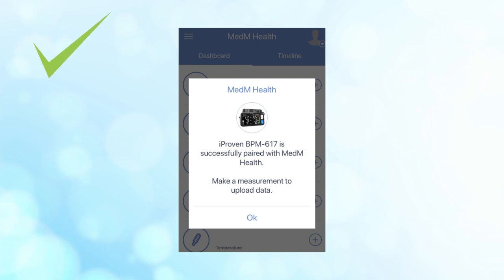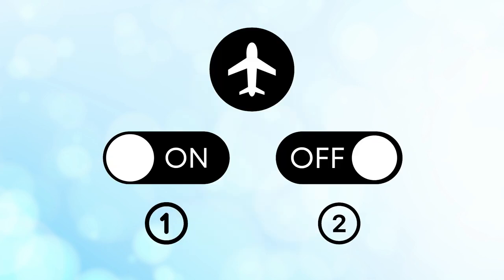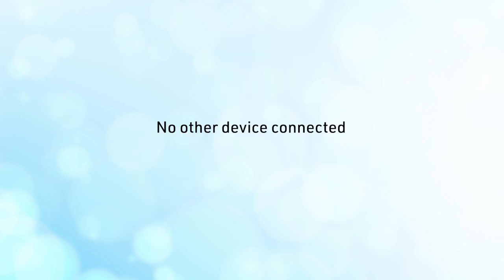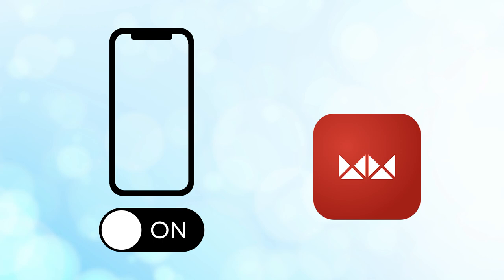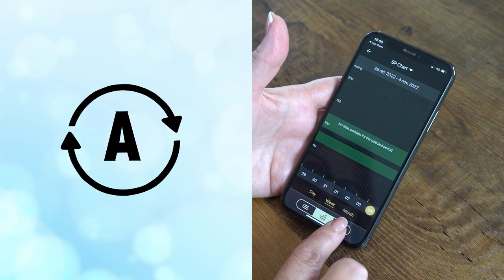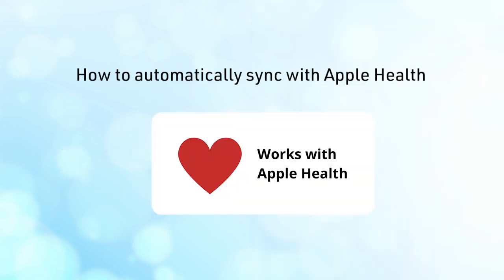If you have trouble pairing your smartphone or tablet with the BPM617, turn on and off the airplane mode to restart Bluetooth and Wi-Fi. Also, make sure that there are no other devices connected. Once paired, keep the phone screen on and the MedM app open to sync with the BPM617. As you get new blood pressure measurements, the app will automatically register and show them.